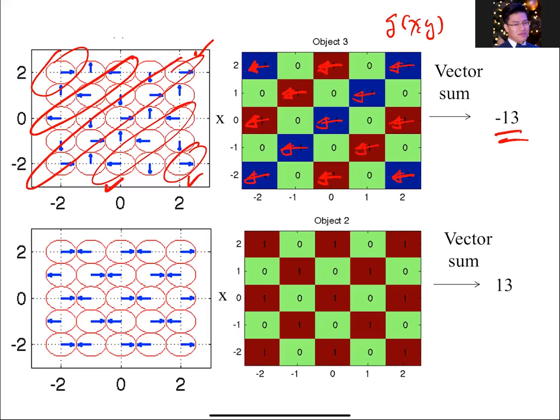Oh, so it's just like the magnitude of the magnetization, or the T1 or T2, I mean, for the G? Yeah, that's a great question. The ones with -1s would mean that at that point, for some reason, the phase would be flipped by -1. Later on, we might show that you can get that by having something flowing in a certain direction with a certain pulse sequence. But for now, just think of it as a theoretical, imaginary object. Don't worry about that for now. It's just to get through the math of this.